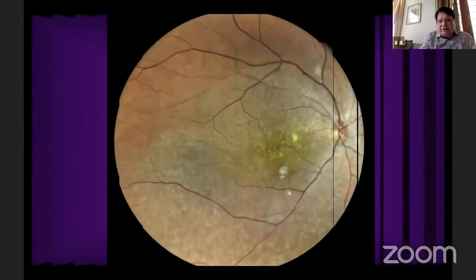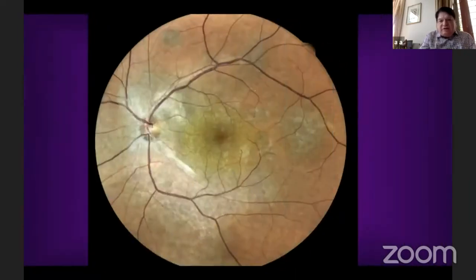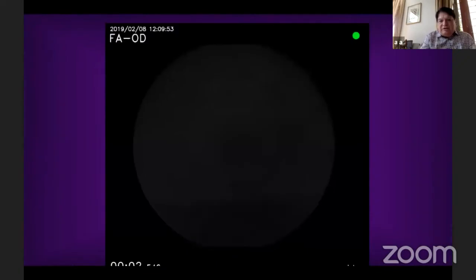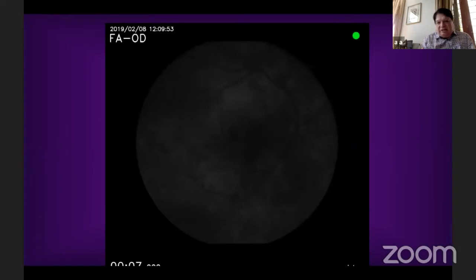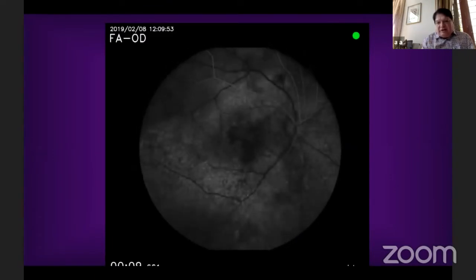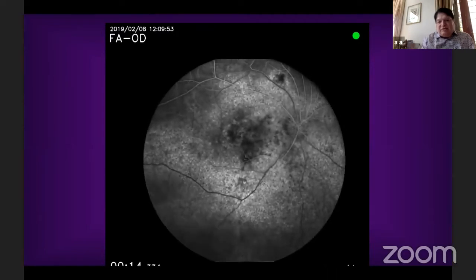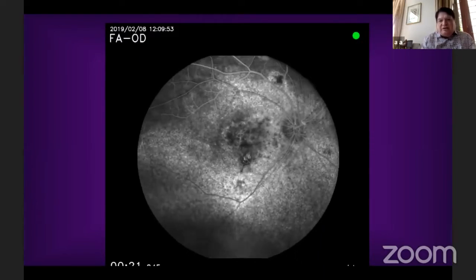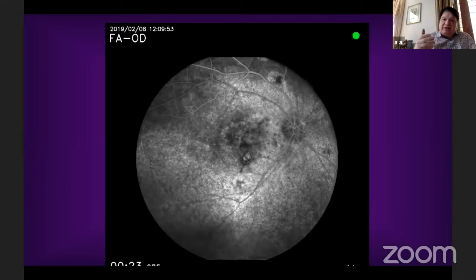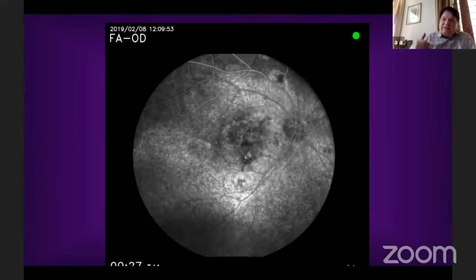If you see the video angiogram, you will find that there is a definite difference in the circulatory pattern. I'll show you. Just keep watching this video angiogram. You see the artery starts filling, the upper one starts filling earlier than the lower one. Upper one fills better than the lower one. All these features suggest that there is an arterial blockade also. This is where the difference starts, that you have to start searching whether this is behind, how much behind, and is it at the disc level or is it behind that?